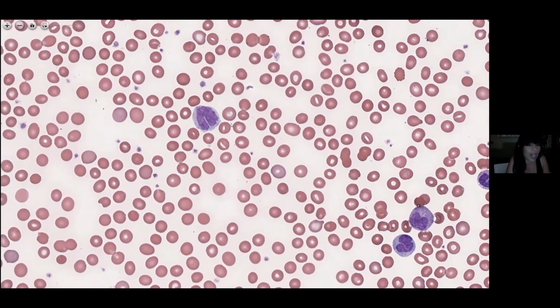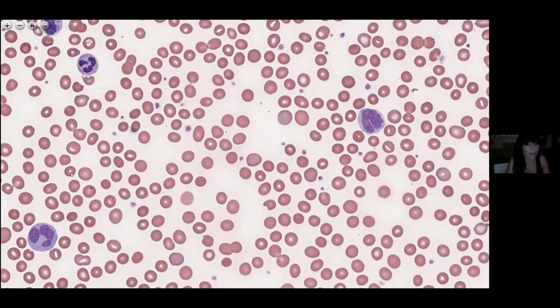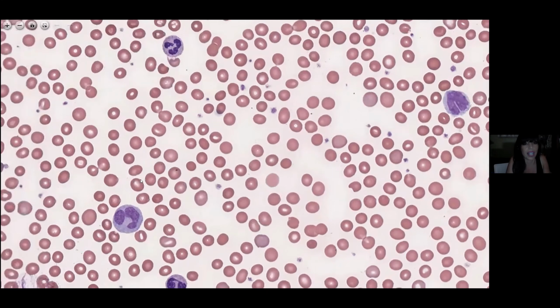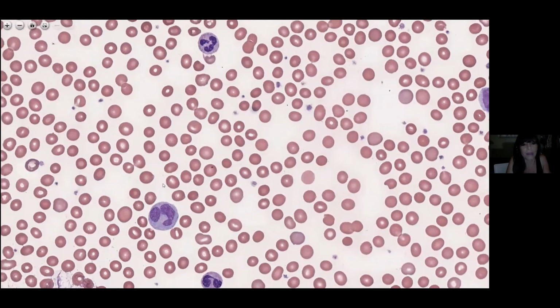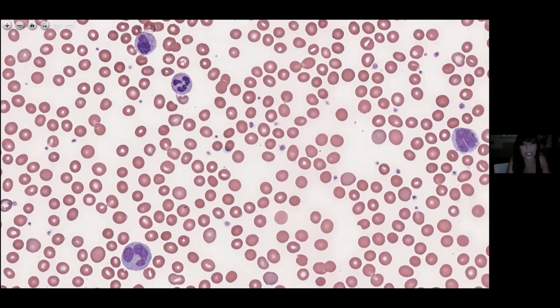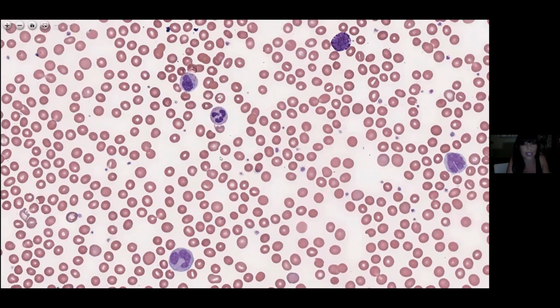Yeah, I think it is. We have a pretty good charting system, so most of the information is in there. But I could imagine it could be hard. I know sometimes with getting prior bone marrow results, like from 10 years ago when they want to correlate them, they've had issues finding those or being able to get a hold of those slides to make the best report.